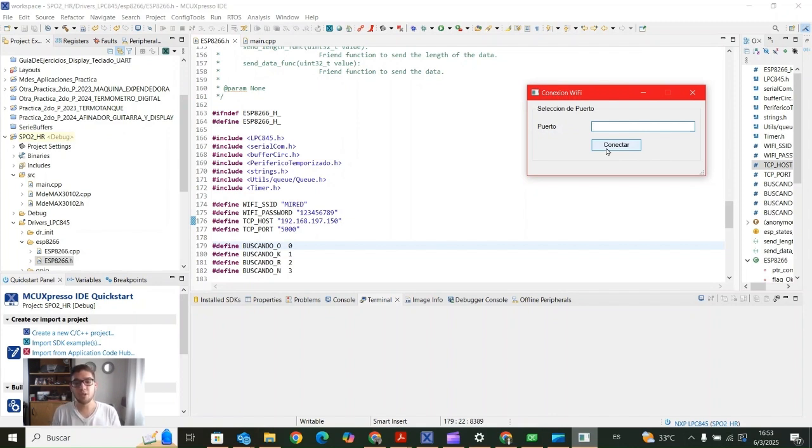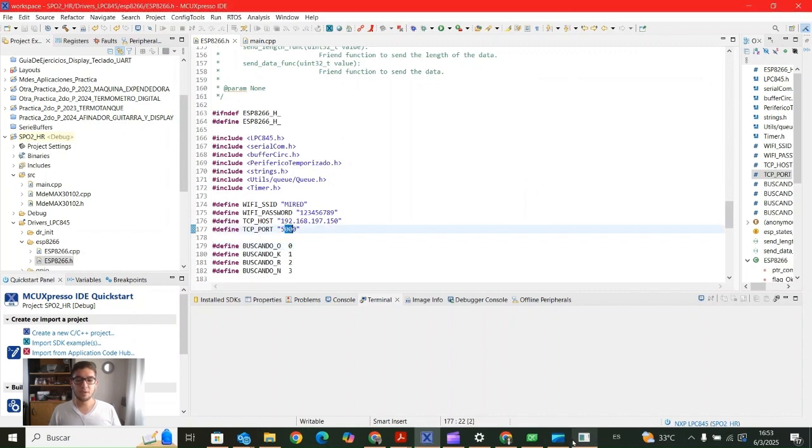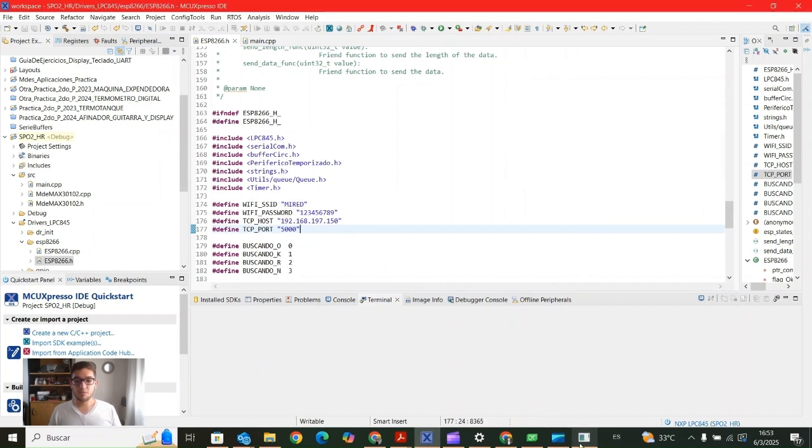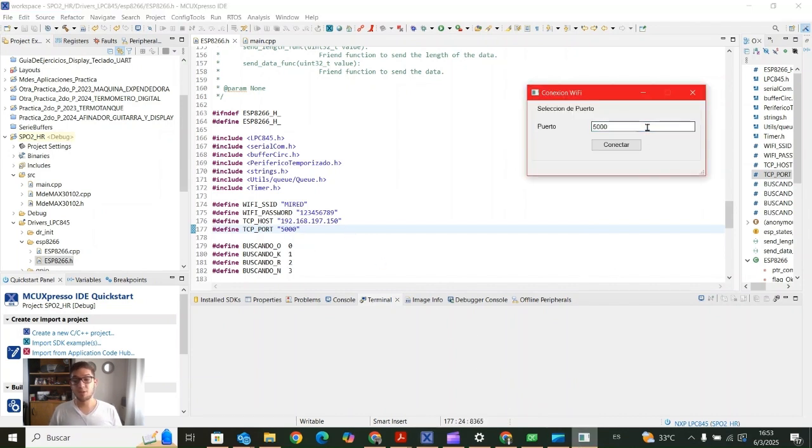The first window that you should expect to be opened is the connection Wi-Fi window. Okay. Now we are going to write 5000. This is the port number. Again, you can choose any port number that you want. You should write the same port number here and here. 5000 is a good port since it's not used by the computer usually.